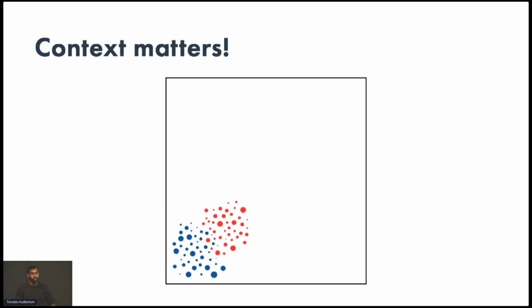So clearly, the way that we are quantifying these tissues has a big implication on the spatial relationships that we quantify, which is actually a problem because that means that spatial relationships found in one patient image may not be transferable to other patient images, which highlights a critical barrier to identifying consistent spatial biomarkers across diseases.